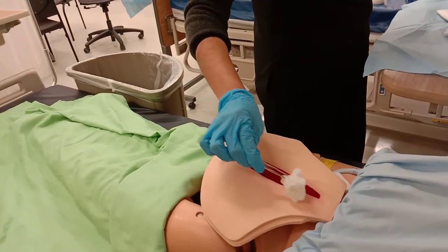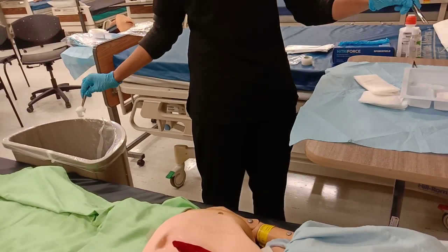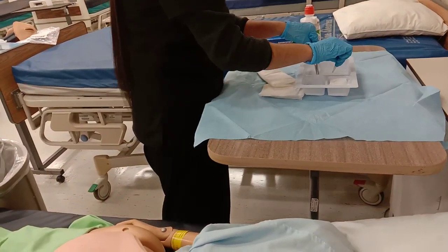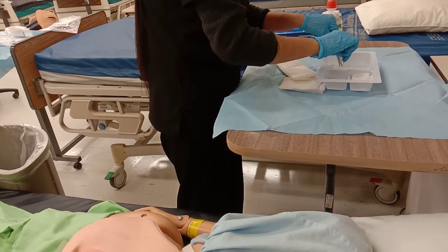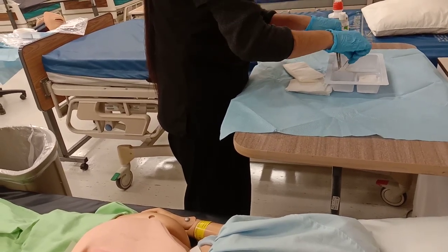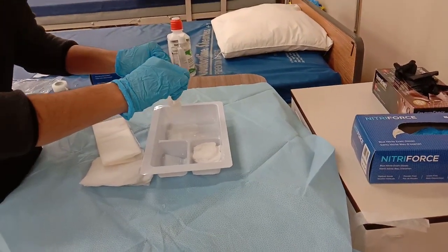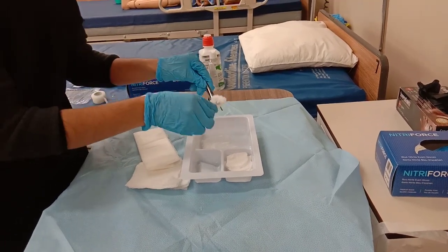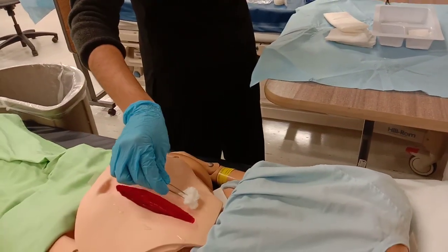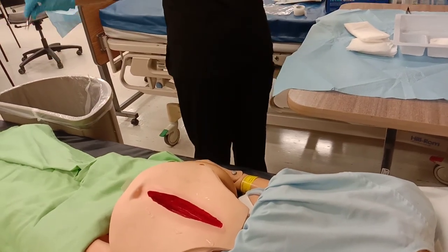I'm cleaning the midline, which is away from my body, and then garbage it. I'm going to squeeze it appropriately. I'm cleaning now from the midline, one stroke, and the periphery, which is near to me.